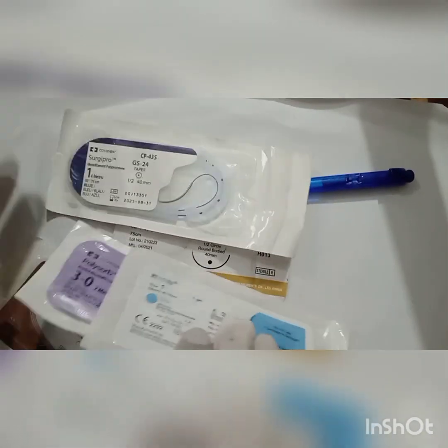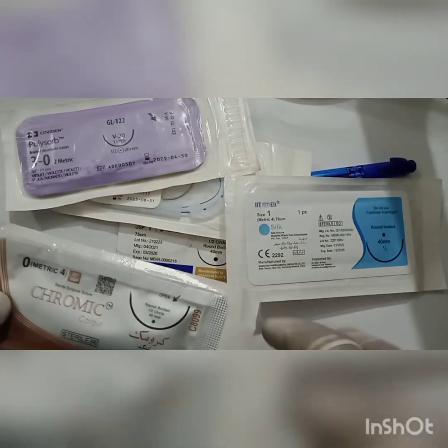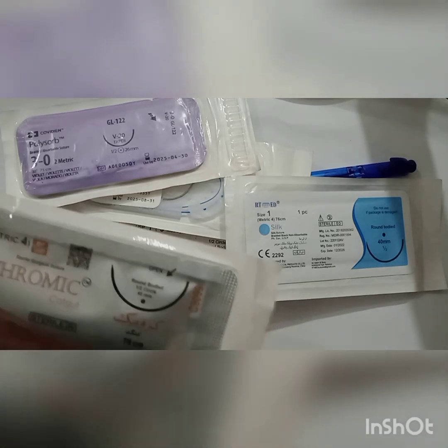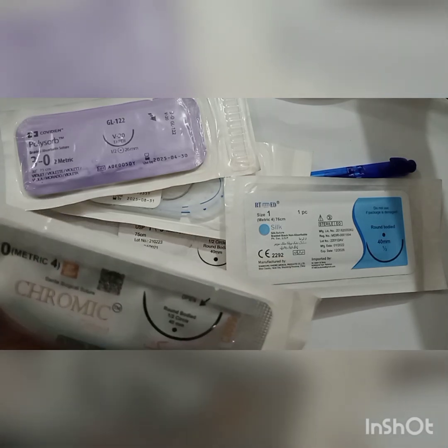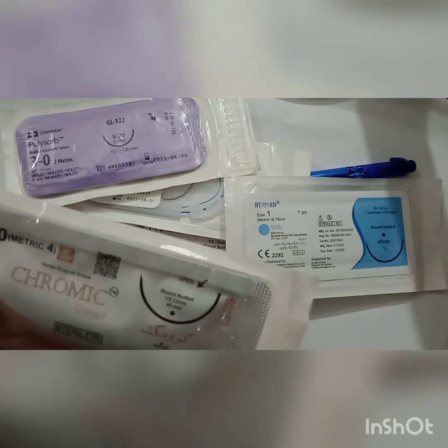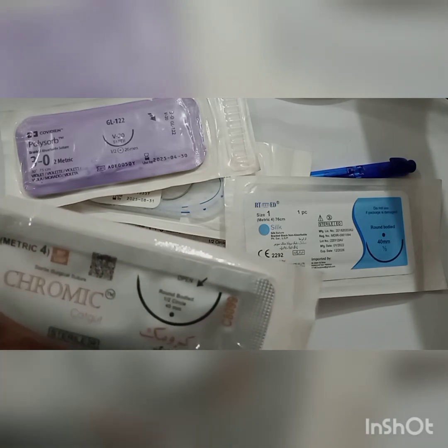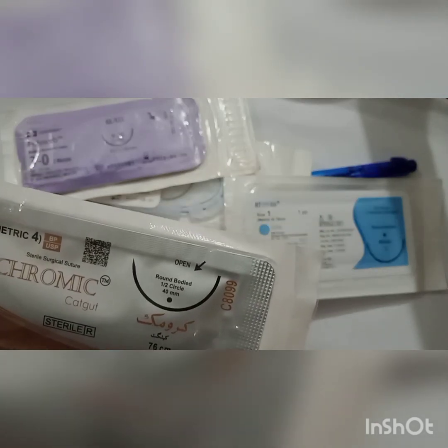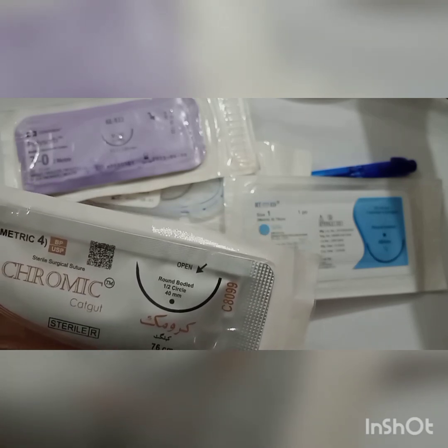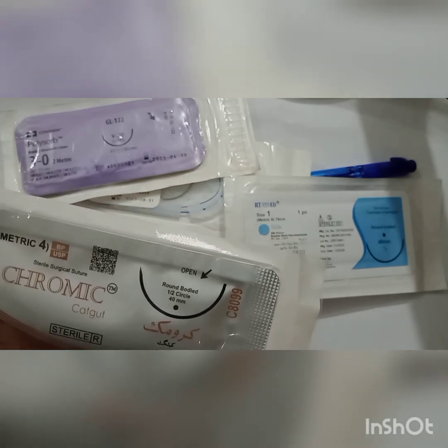Different absorbable sutures have different durations of absorbability. Catgut may be plain, without the coating of chromium salts, or chromic, which increases the absorbability duration of that suture. The plain catgut might have an absorbability duration of 1 or 2 weeks, and the chromic may be more than 3 weeks.